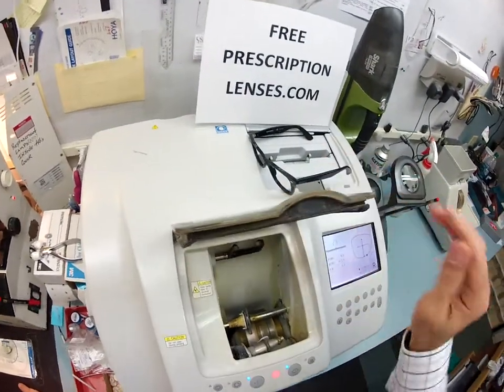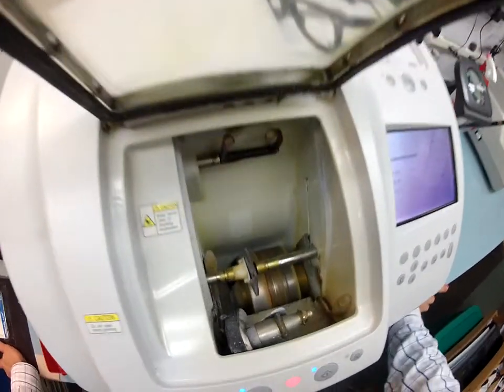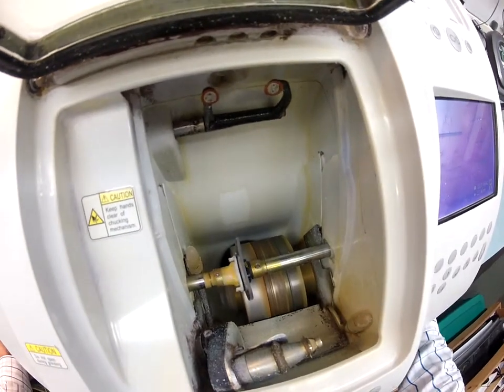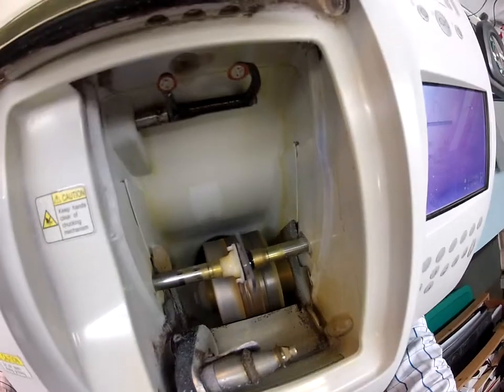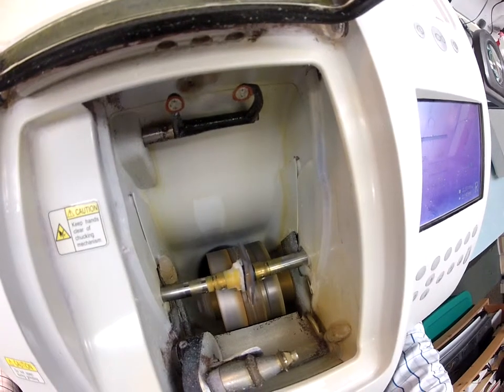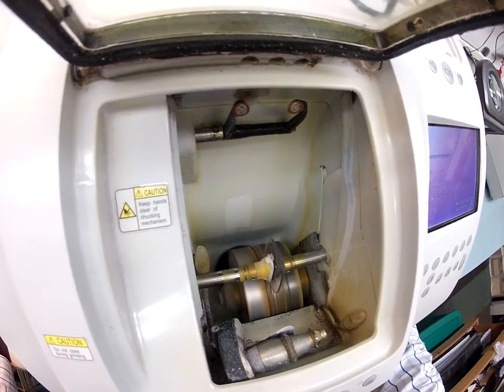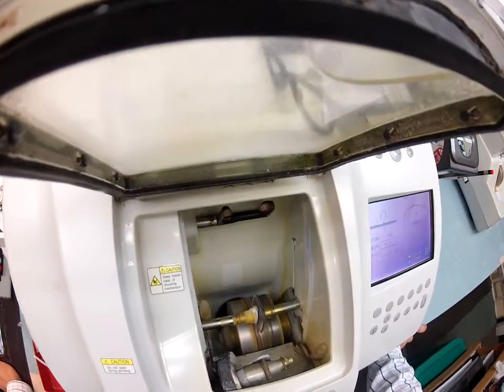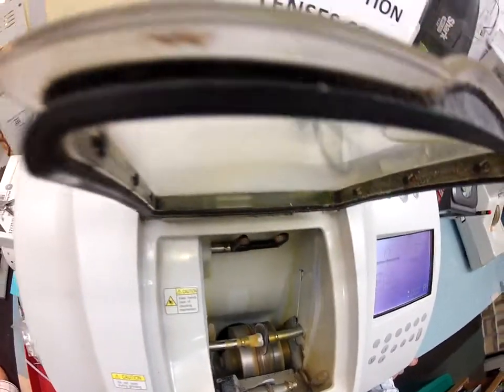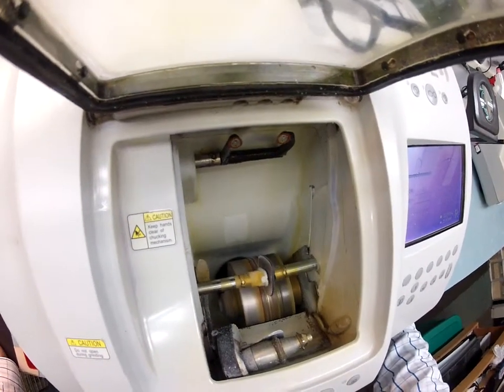If you notice, it's still completely flat all the way around. In a moment it will move over and put the bevel onto the lens, which it's going to do now. No longer is it going to be flat-edged like a nickel — it's now going to have a knife-like edge. Sharp enough to cut wet paper, if you're really strong and can push through it. A little bit of water is going to kick in to wash away the debris that has built up on the lens.